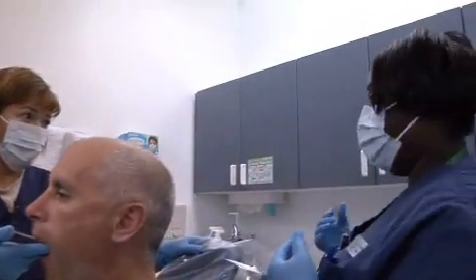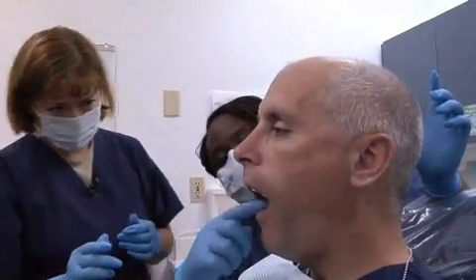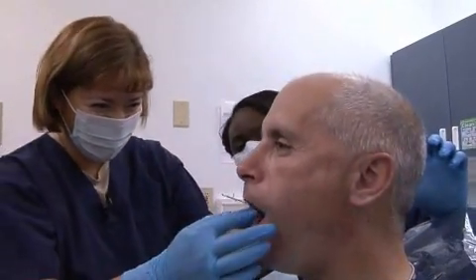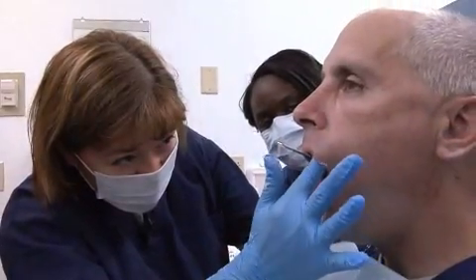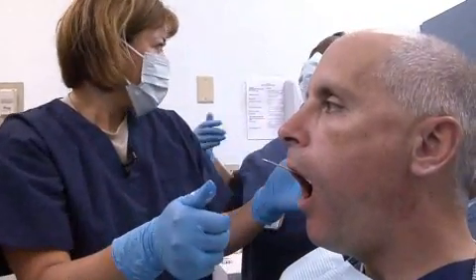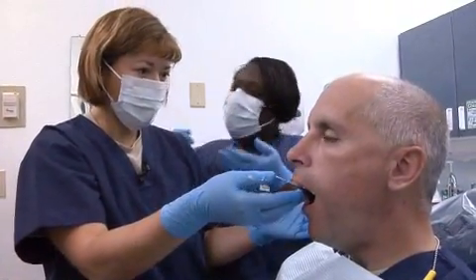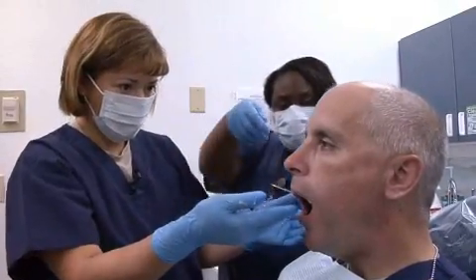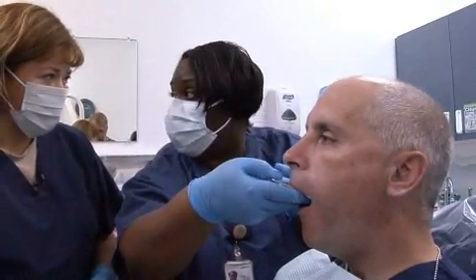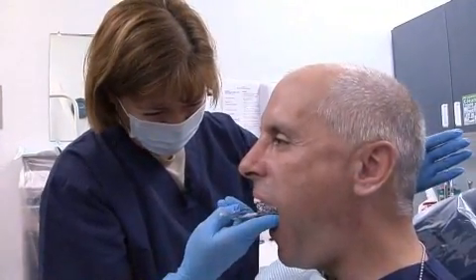That mixture feels like it has set. So now to remove it — just take your fingers and go up along the side to release it. Like that. Go ahead and rub along the area on the other side too. Then you'll have him say 'ah' because this is gonna pop the suction. Take your fingers to protect the bottom teeth, because when it comes out — come along like this, holding it down, then have him say 'ah' and pull down. Ready? Ah. Got it.